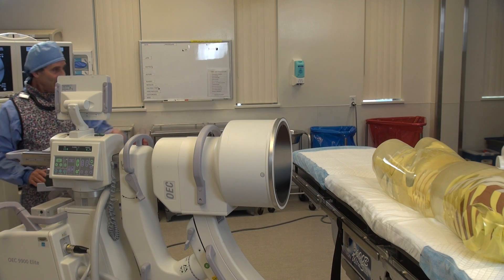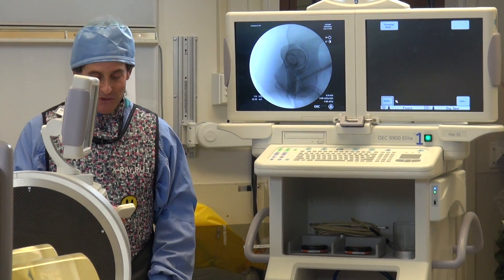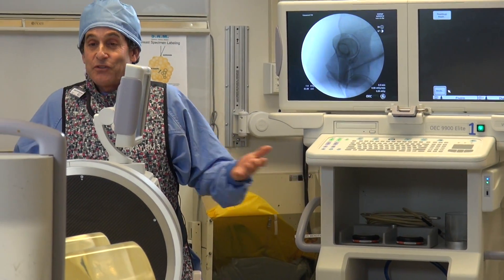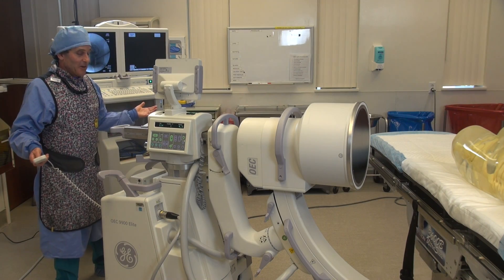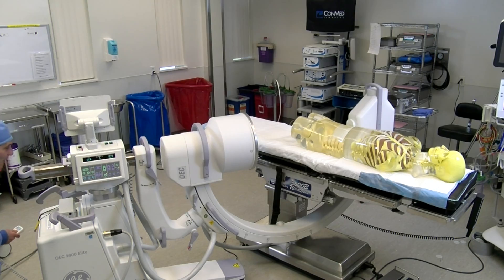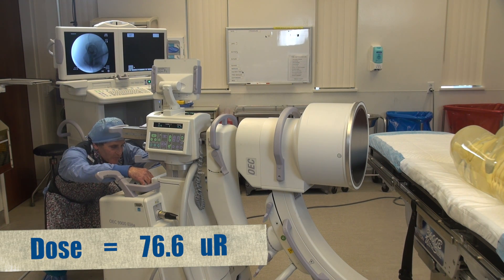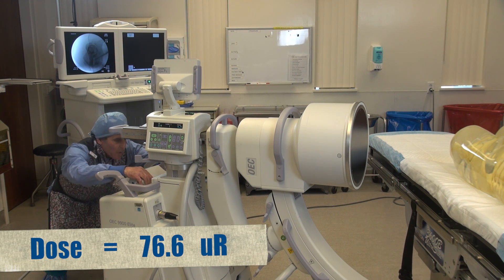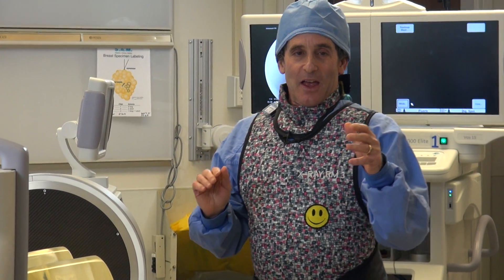I've got my dosimeter right here and the ion chamber is over there. I'm going to duck down — something I've done my entire career and I'm not going to stop now. Here we go with our next digital spot exposure. The dose is 76.6 microR.